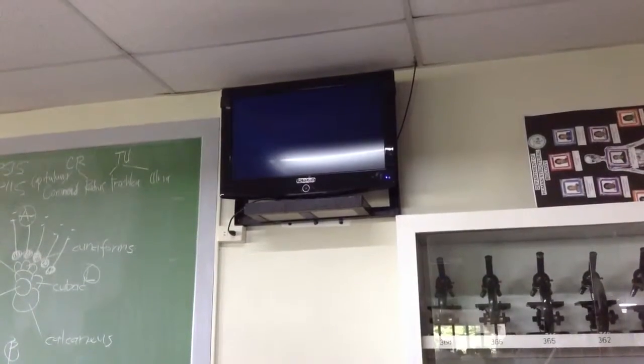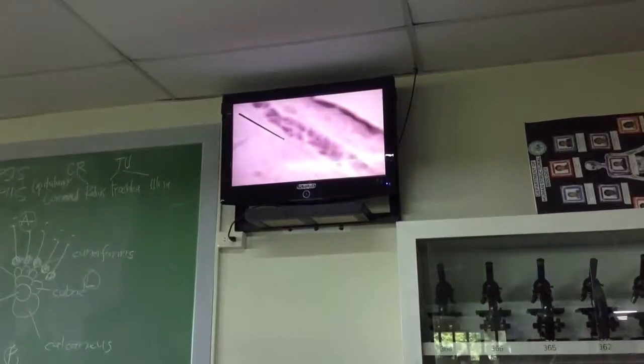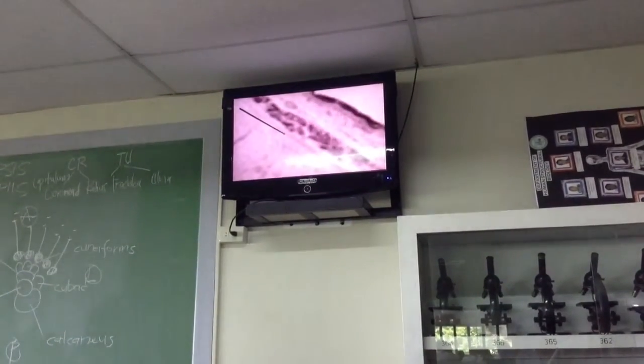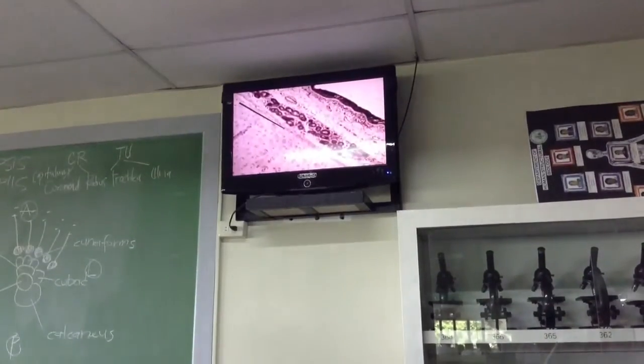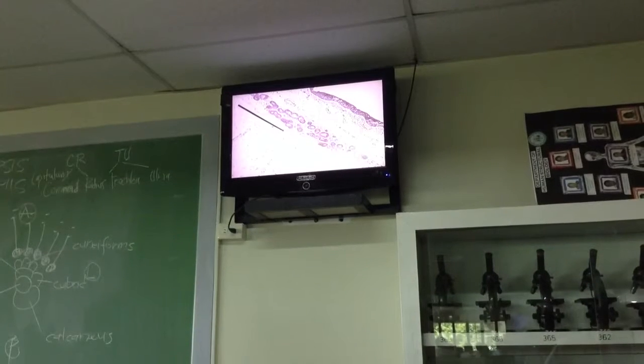that will be shown today. The first of which is this. Scanner view. Can you identify the organs shown at the monitor?